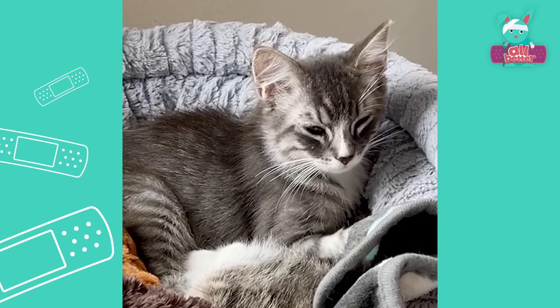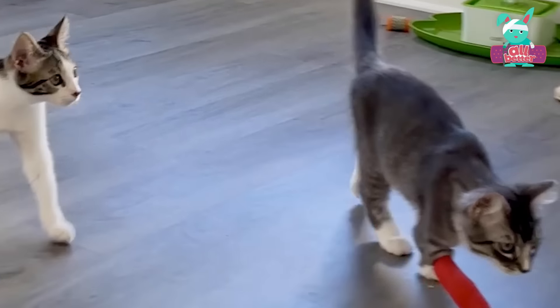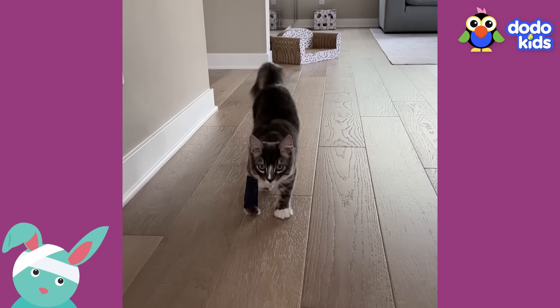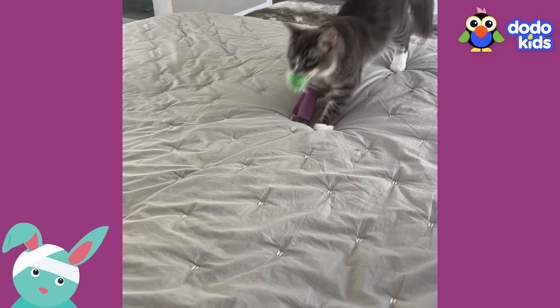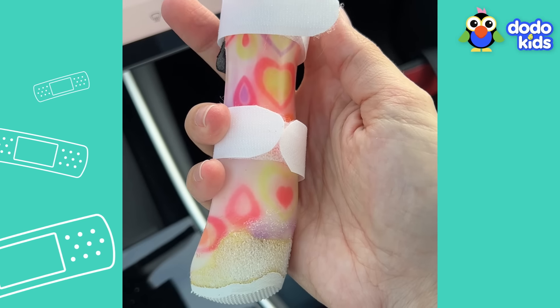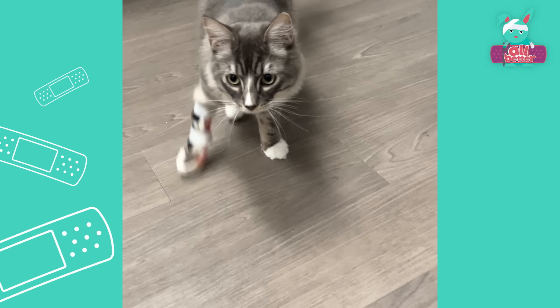Good news, Sebastian. We're all done with the acu-scope therapy. But you're still limping. Even though the electricity healed your muscles, you're still too nervous to use that leg. The splint is helping a little, but we'll need to do more — like this! A special custom-fitted bootie made of super strong plastic to give your leg lots of extra support.